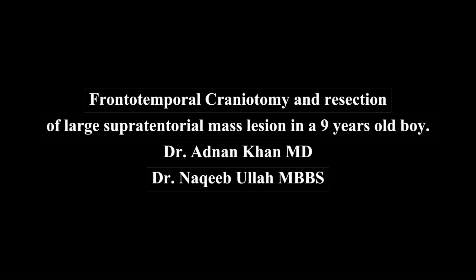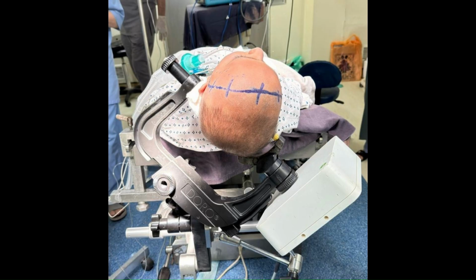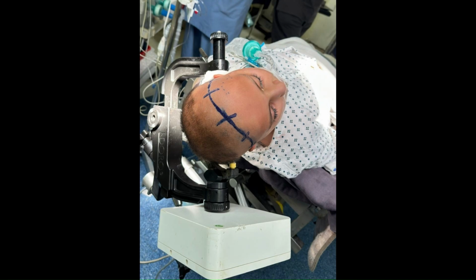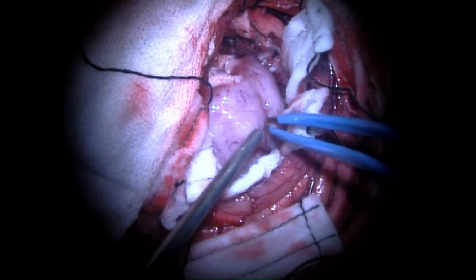This is a video illustration of a frontotemporal craniotomy in a 9-year-old boy who had presented to us with headache and drowsiness. His MRI brain with and without contrast showed a large contrast-enhancing lesion causing significant mass effect. He was placed supine with head fixed in Mayfield clamp. Patient was registered on neuronavigation.